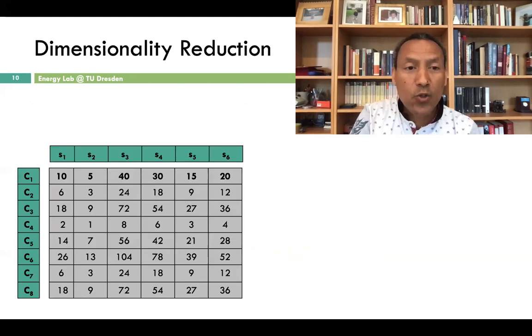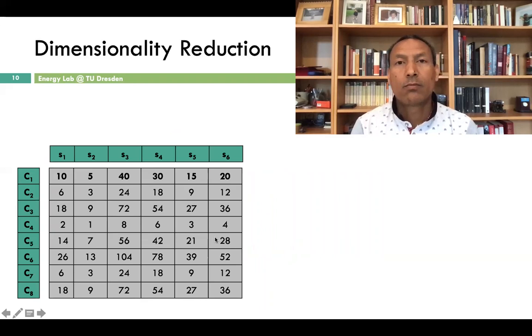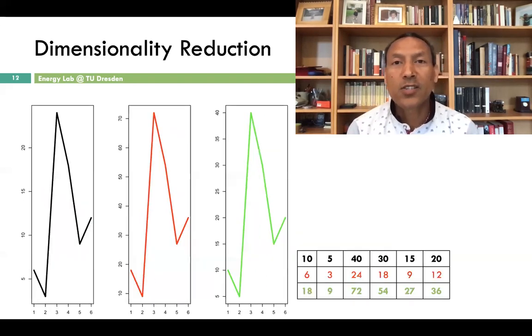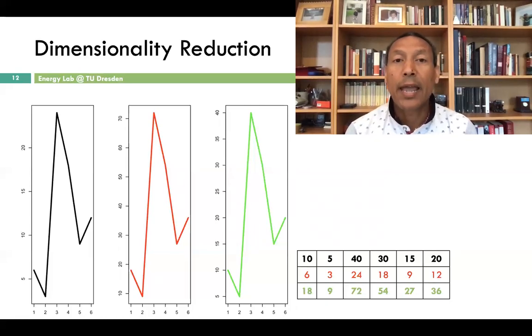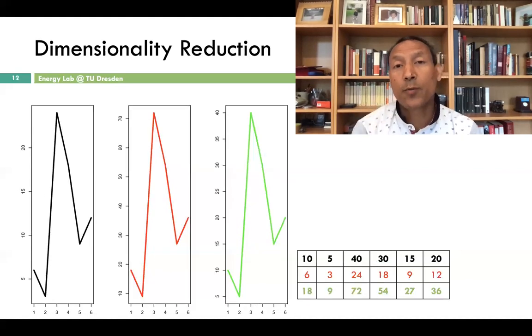Similarly, we can also plot the channel values. And then if we do so, this is also what we get. The waveforms are the same, but the values are different. And yet the vertical waveforms and the horizontal waveforms are different.